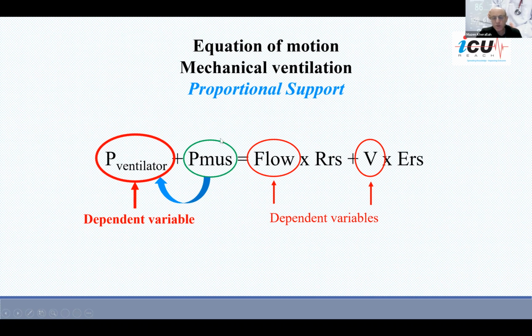If the patient is breathing too heavily, is using accessory muscles, that's too much pressure. At that time, there will be a feedback to the ventilator to support this patient more, so the machine will utilize higher pressure in order to help the patient.